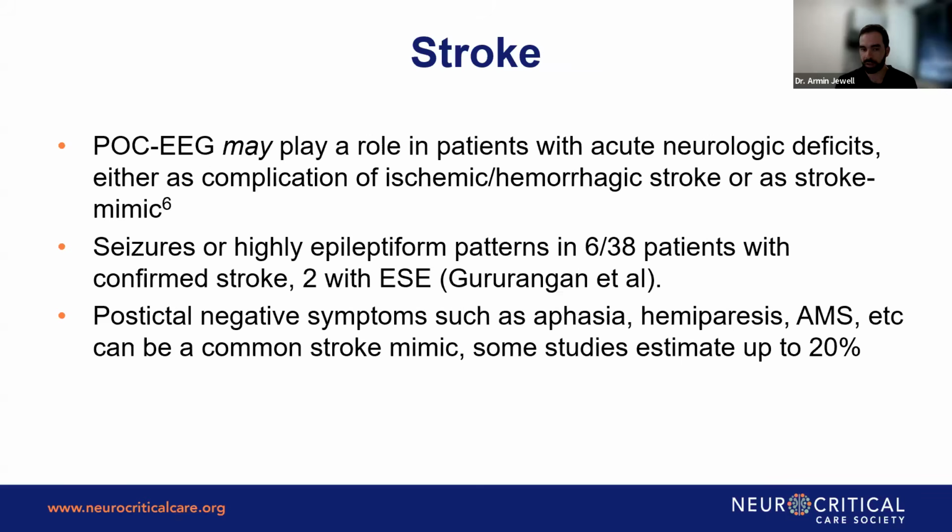And this is a common mimic, and some studies estimate up to 20% that we're seeing that these are actually a seizure phenomenon instead of a vascular or structural phenomenon. And that's something that the point of care EEG can be used for, in the right clinical setting, to rule in or out. Are there also seizures happening as a result of potentially fluctuating symptoms or other things that would cause similar presentations to stroke?